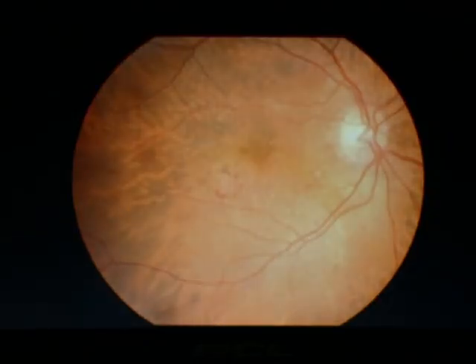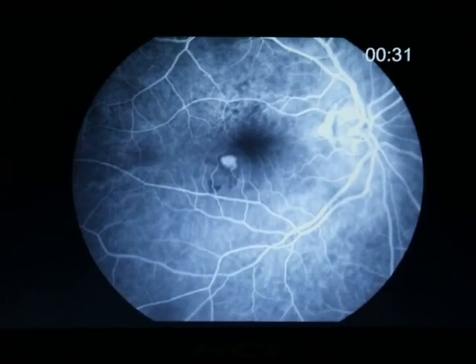Although anti-VEGF agents have largely supplanted laser in the treatment of CNVM, select extrafoveal membranes are still amenable for laser treatment. Here, an overlapping tight pattern of laser is done and is carried around the choroidal neovascular membrane for about 100 microns in order to achieve complete ablation.